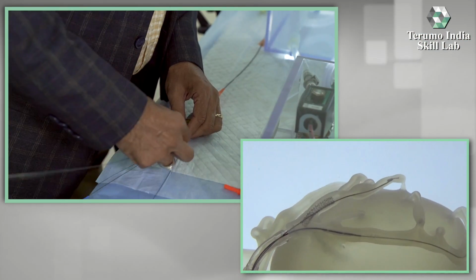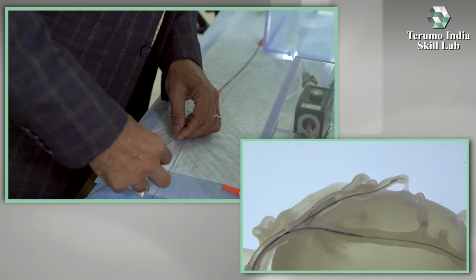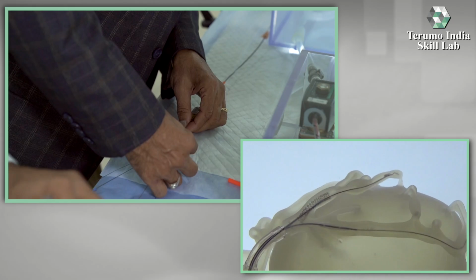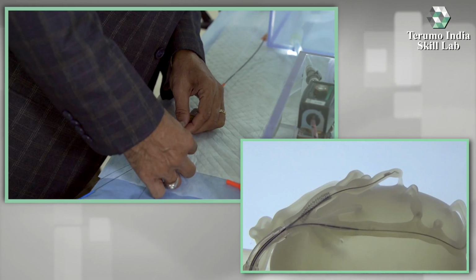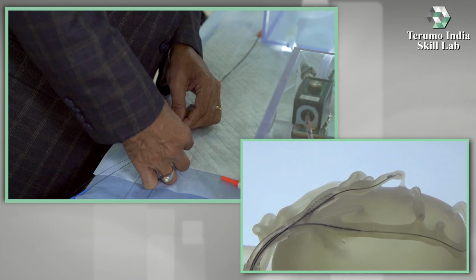So for the side branch optimization, the balloon should always be NC, non-compliant, so that the side branch is optimized, the ostial deployment is optimized at good pressure.